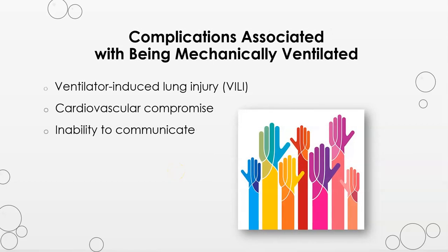Ventilator-induced lung injury is also known as barotrauma. The alveoli have become over-distended and rupture, causing a pneumothorax. This could be the result of too high tidal volumes or pressures. Frequent lung assessment is key, and collaboration with respiratory therapists. In past slides, I have expressed this, with decreased preload and cardiac output secondary to PEEP.